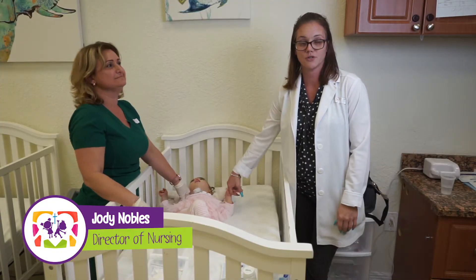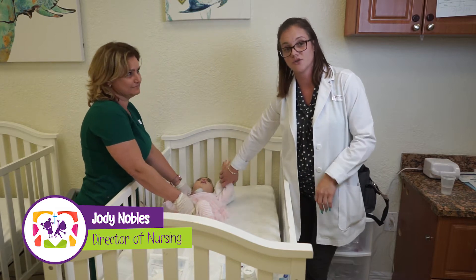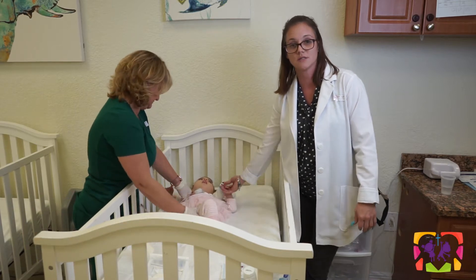Hi, my name is Jody. I'm the director of nursing at GTG-PPEC. This is Leda, one of our nurses. We're going to be demonstrating trach care. This is Jaylin, a two-year-old with a diagnosis of cerebral palsy and respiratory insufficiency.